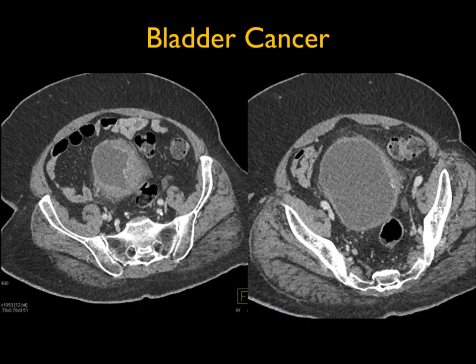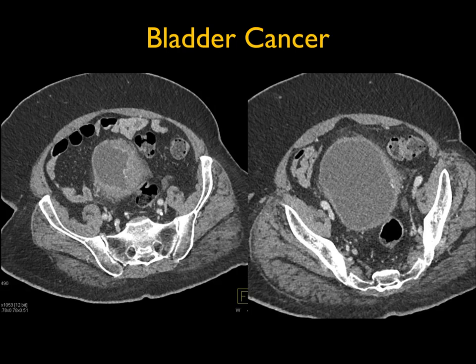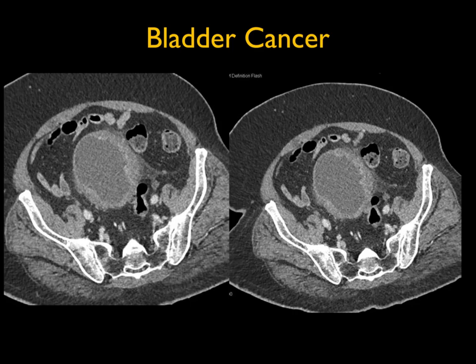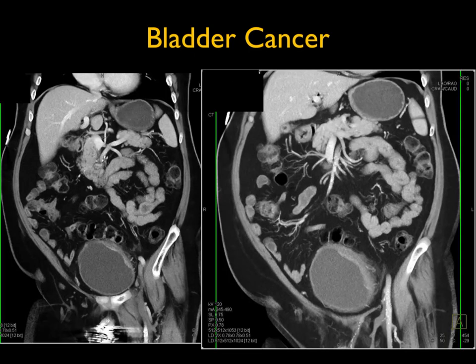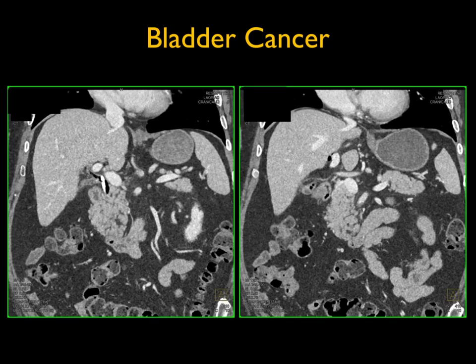Case two is a case of bladder cancer. The importance of good bladder distension is key — we like to give patients 750 to 1,000 cc's of oral contrast before the study and encourage them not to go to the bathroom. Any little enhancement in the bladder will be suspicious for malignancy. This case shows definite wall thickening on the left side of the bladder, very classic for bladder cancer. Infection can cause bladder wall thickening with cystitis, but it's usually more circumferential, not focal.